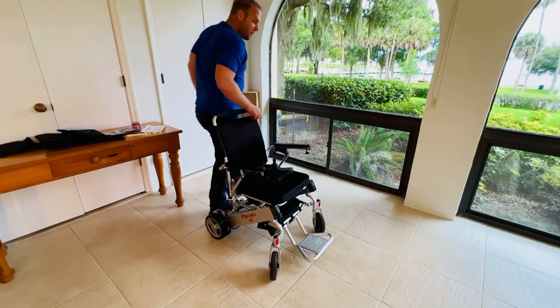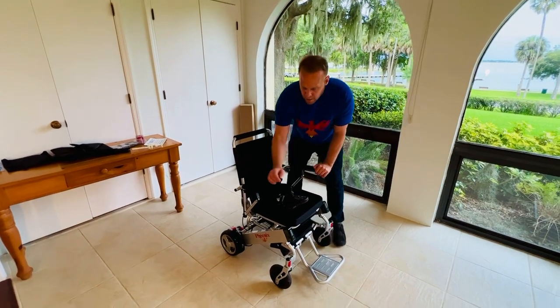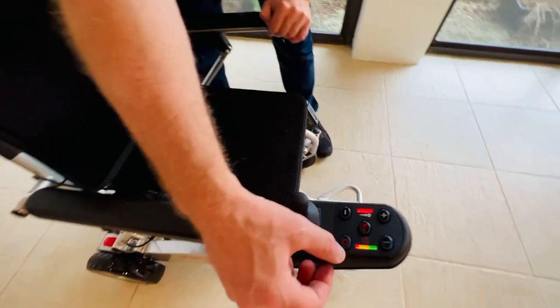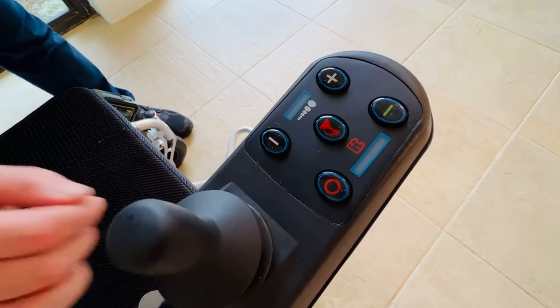The Phoenix is a very simple chair and it has the in-frame battery design. This is a battery, this is a battery. If I turn the chair on, I can see there is an indicator on the joystick that is going to measure the totality of both batteries charged.